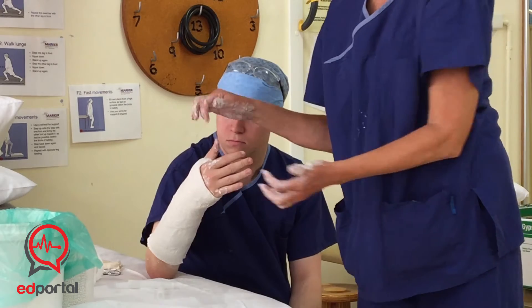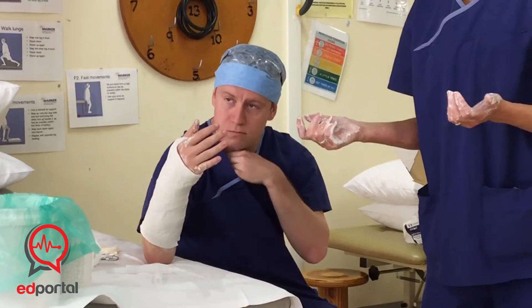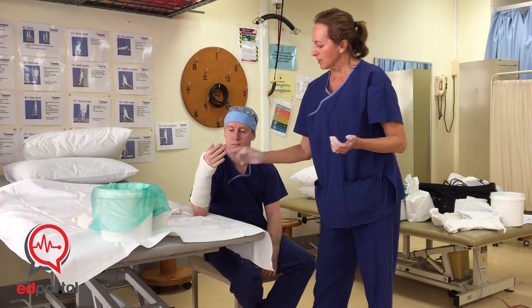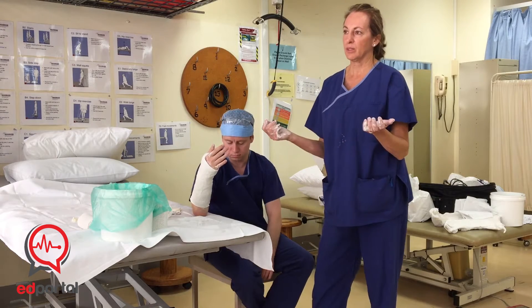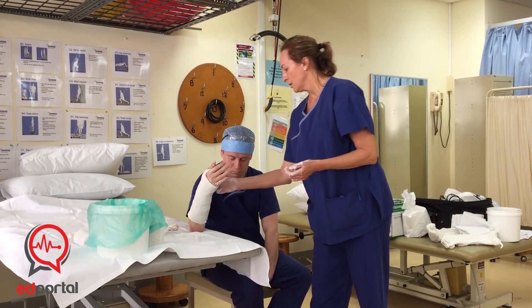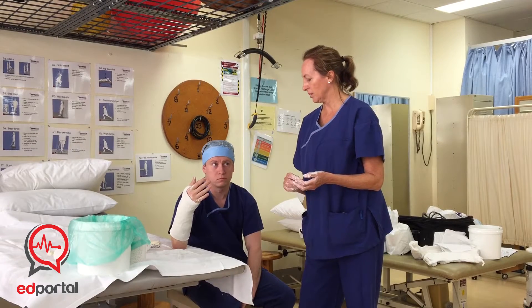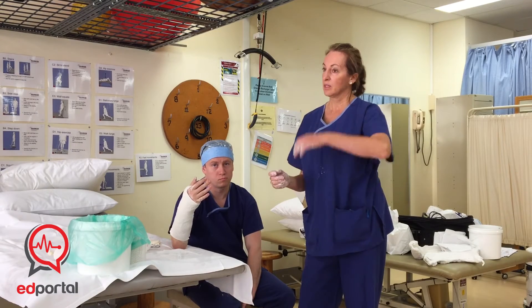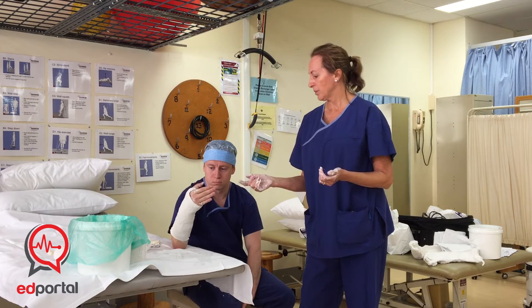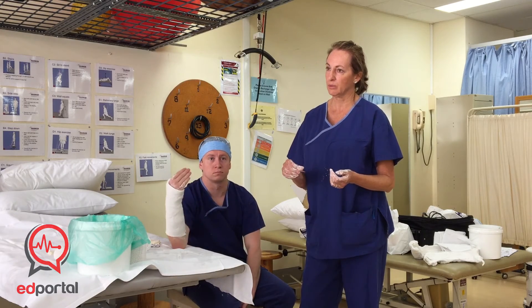Now it's just a matter of cleaning that up so the patient is tidy to go home. Always put a sling on the patient to go home — they can sit for a while while the cast sets. Things to look out for: if they've got rings on their fingers, remove those. Tell the patient that if they get tingling, numbness, or swelling, they need to elevate the limb. If they don't get any relief from that, or if it's really aching, they need to come back in and you'll have to split the cast.